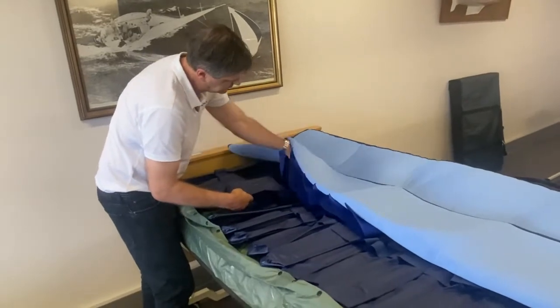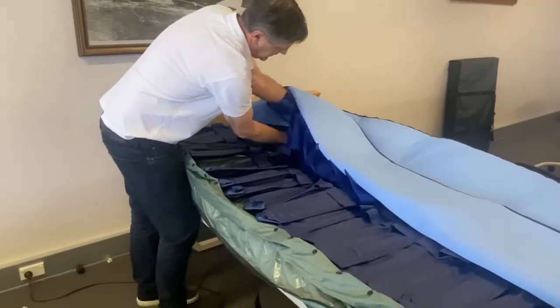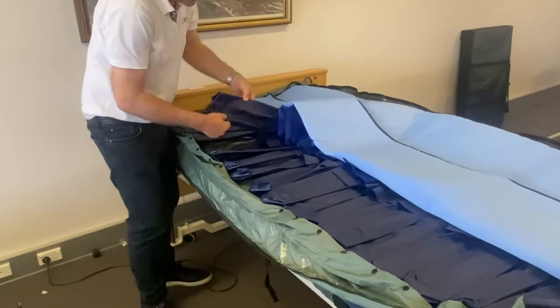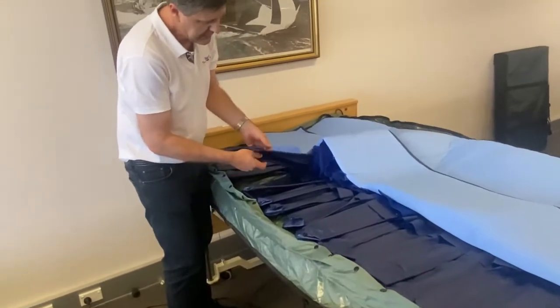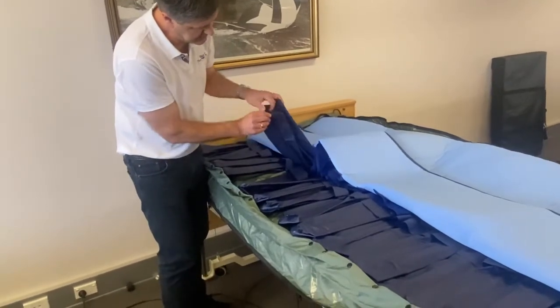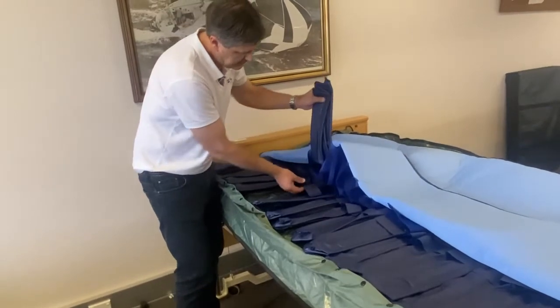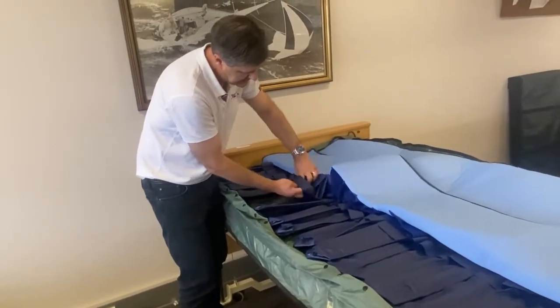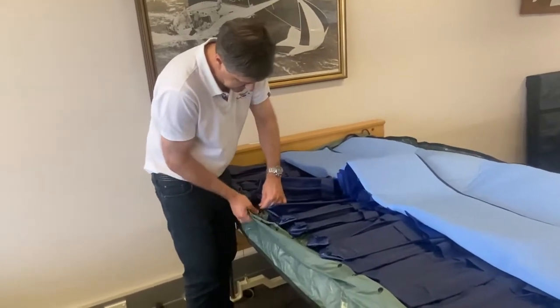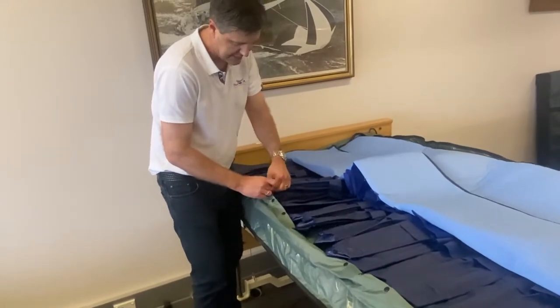We put our hand through the first cell loop and then pull it through, ensuring that there's no creasing happening on the cell loop and that the cell itself isn't twisted. You can tell the upper portion of the cell because it's smooth, whereas the lower portion of the cell has a seam. This needs to be on the bottom. So then we take it back through the cell loop and then clip it back to the base and to the upper line of press studs.